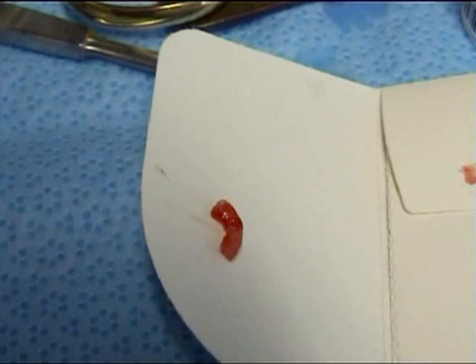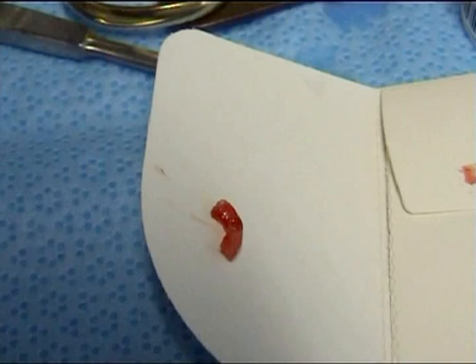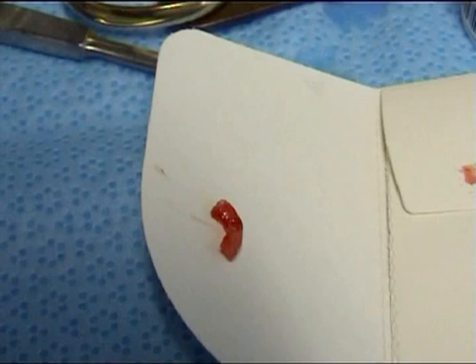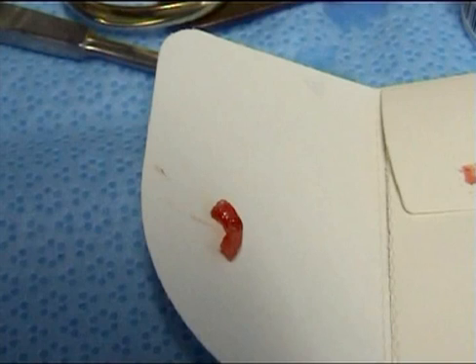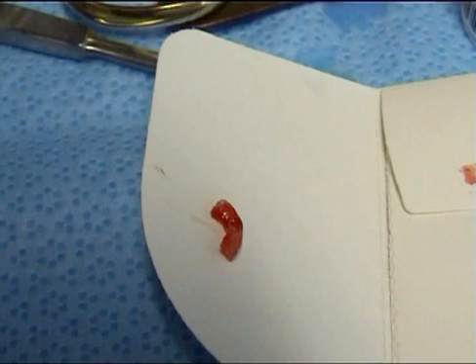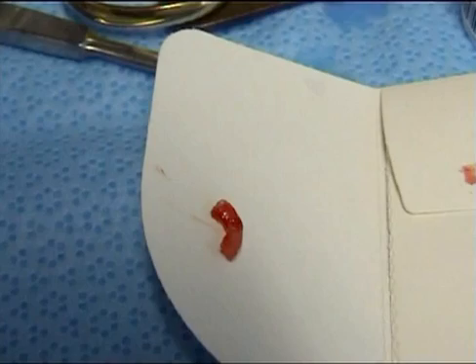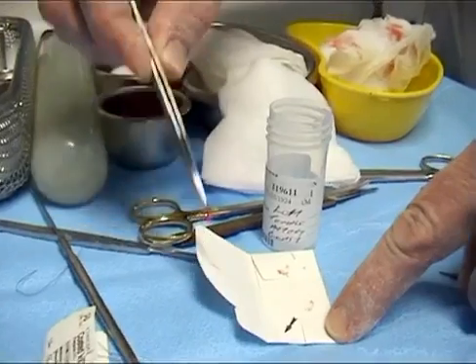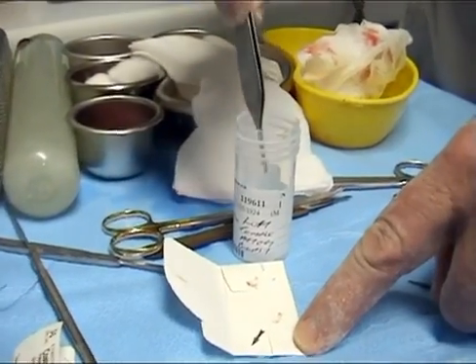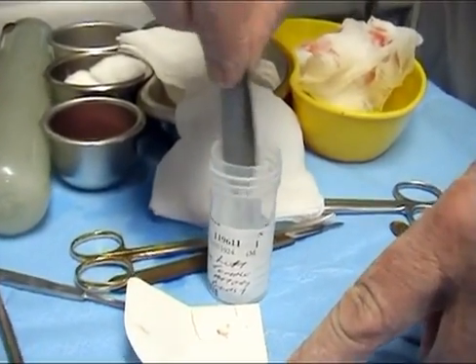The segment of artery will dry quickly and should be placed into a formalin specimen jar as soon as possible. The specimen is then sent for laboratory examination.